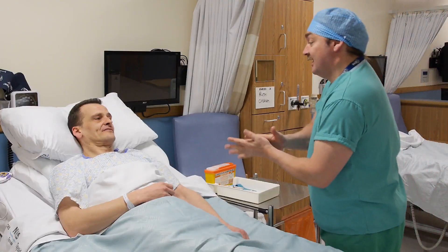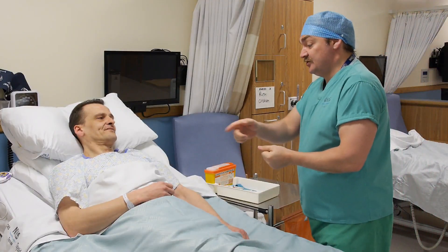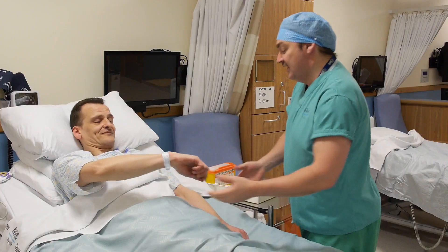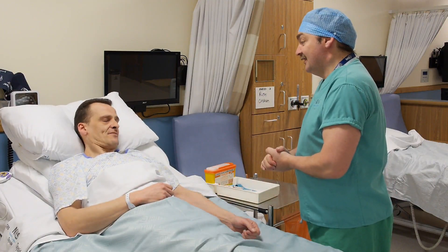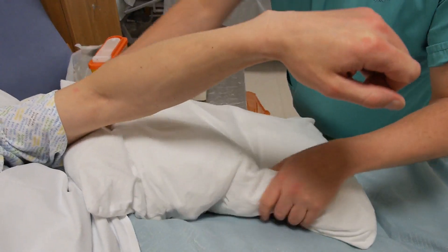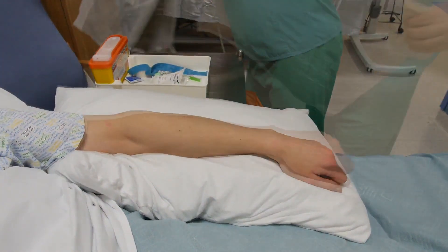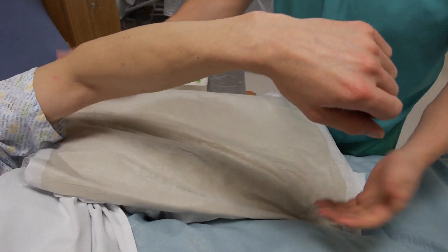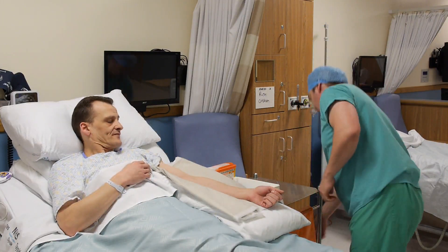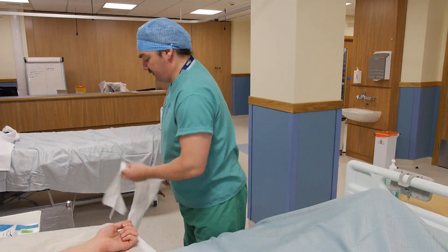Decontaminate your hands, introduce yourself to the patient, confirm identity looking at the name and date of birth, and explain the procedure. Having gained verbal consent, check for allergies, ensure there is adequate lighting and support the chosen arm on a pillow. This is normally the patient's non-dominant arm, which will ensure patient comfort and facilitate venous access.